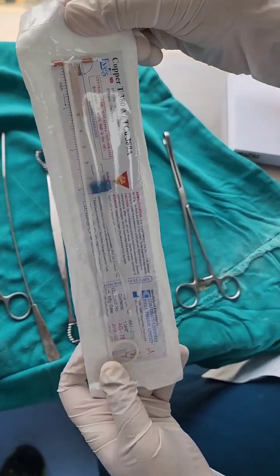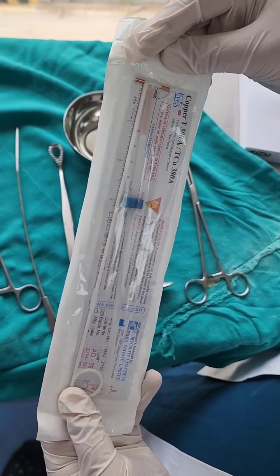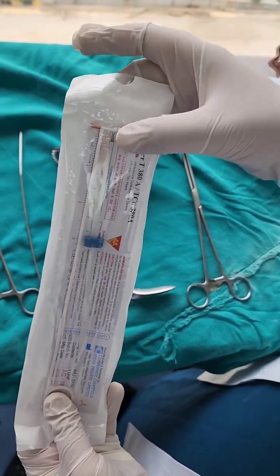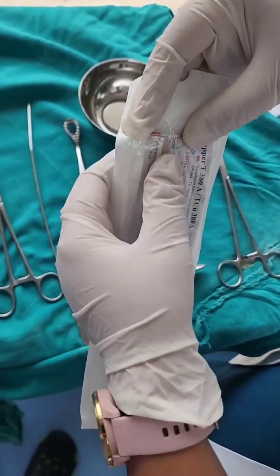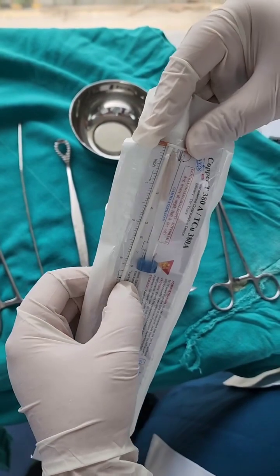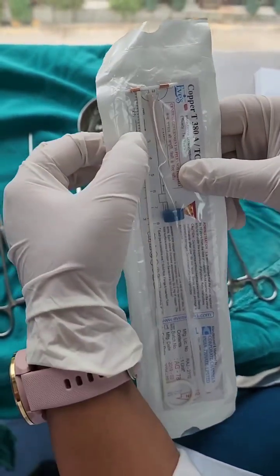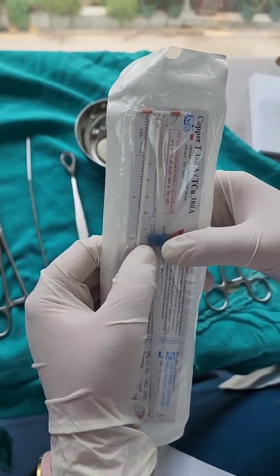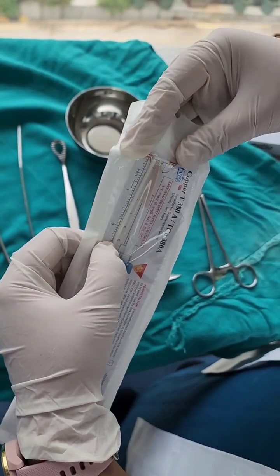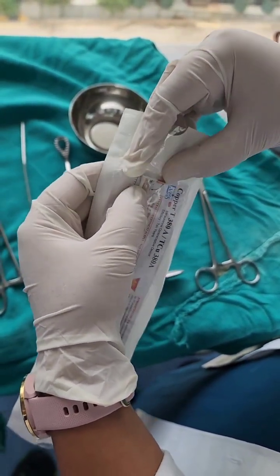This is a Copper T 380A. Very important to understand — we use a no-touch technique to maintain sterility. The copper T has a horizontal limb and a vertical limb. The horizontal limb has to be inserted, before opening the packet, into the inserter. This part is called the inserter, this is the plunger, and the blue thing is used to demarcate the uterocervical length.